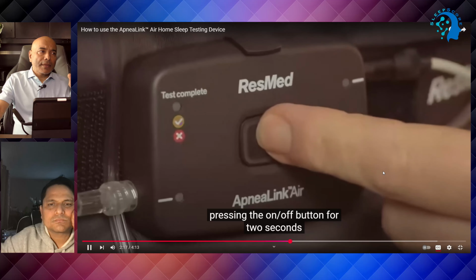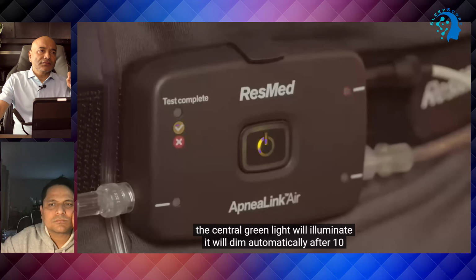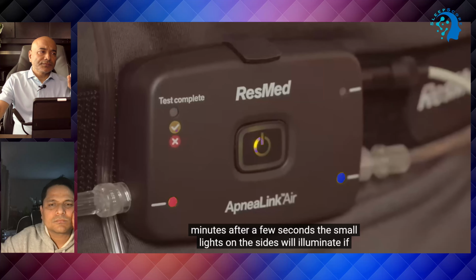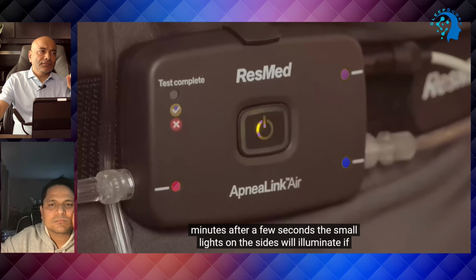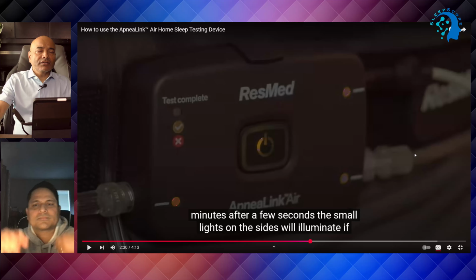Start the Apnea Link Air by pressing the on-off button for 2 seconds. The central green light will illuminate. It will dim automatically after 10 minutes. After a few seconds, the small lights on the sides will illuminate. You see, all these 3 lights are green now.